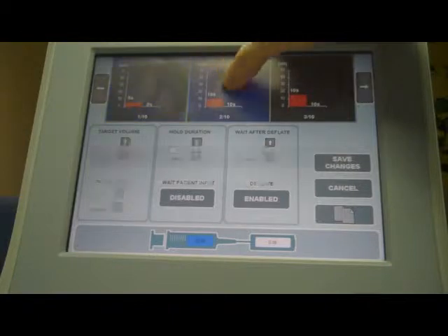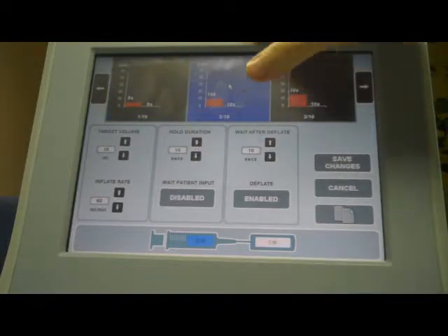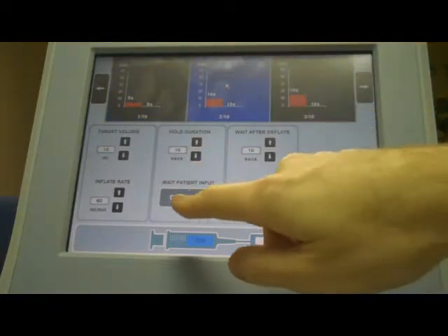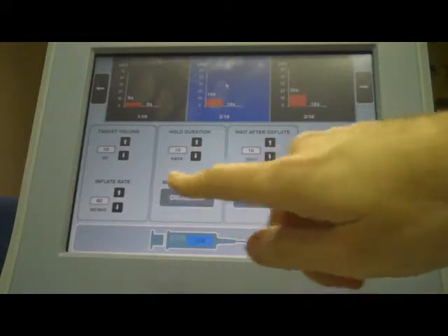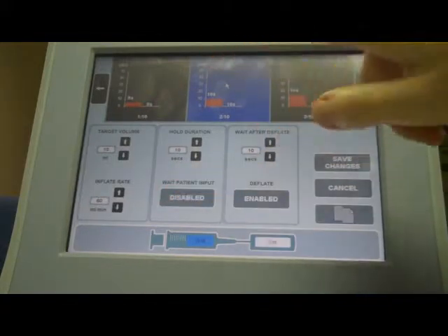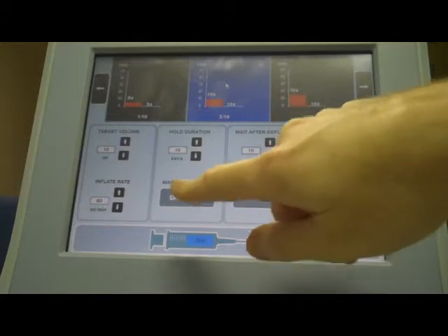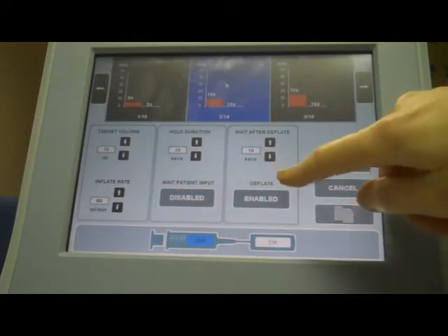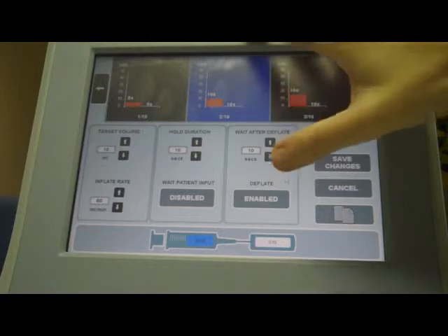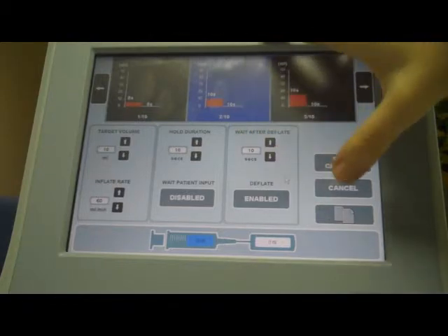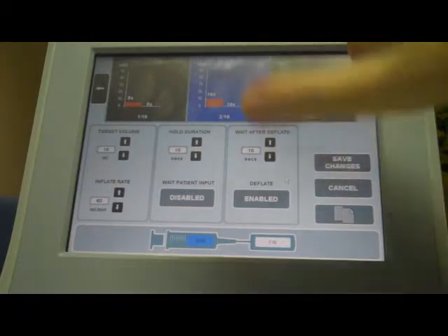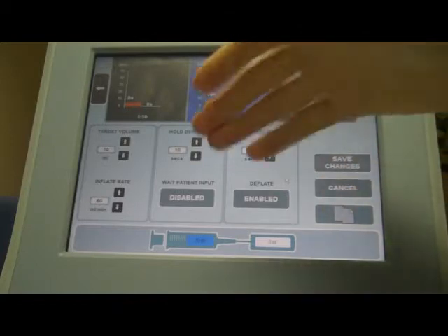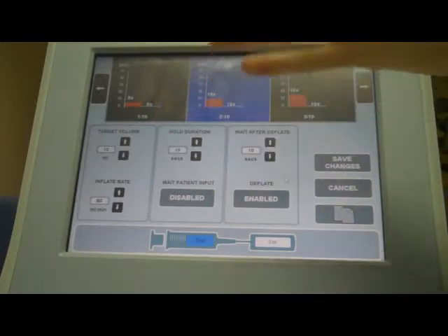To configure more steps, you press each step and configure them accordingly. Note that waiting for patient input and deflating is a global change — so if you make a change in any step for enabling or disabling either wait for patient input or deflate, every single step will either inflate and stop or inflate and wait for patient input.